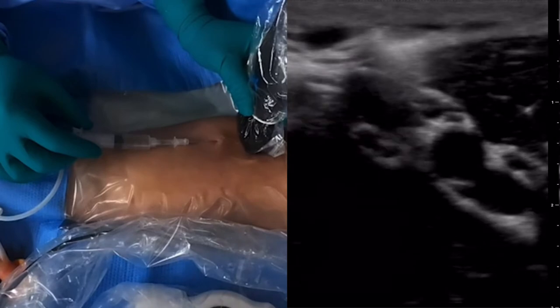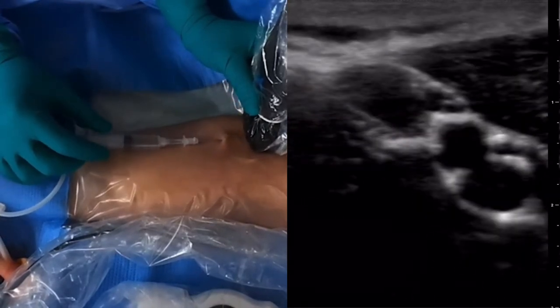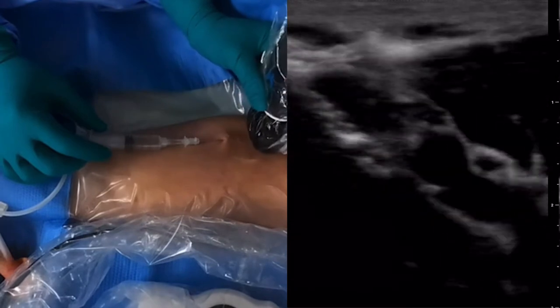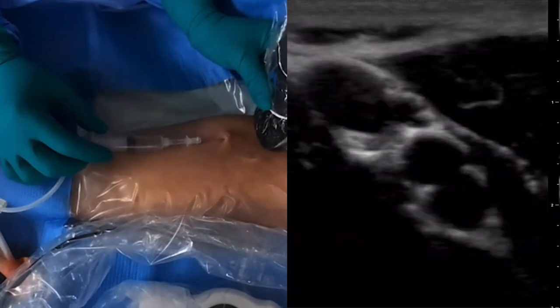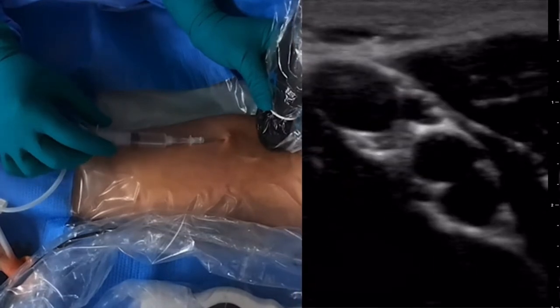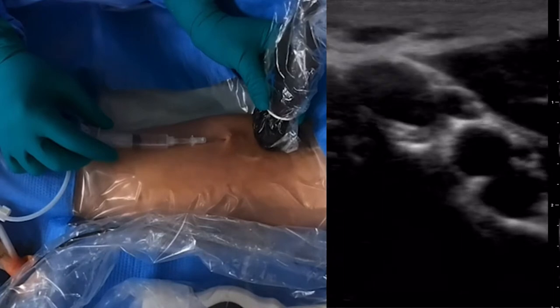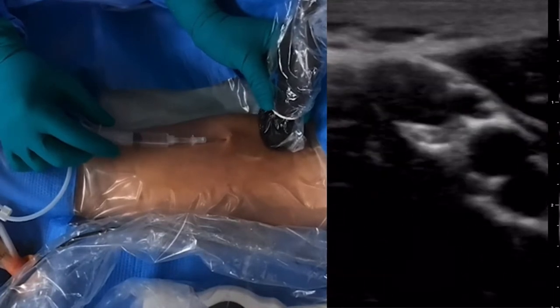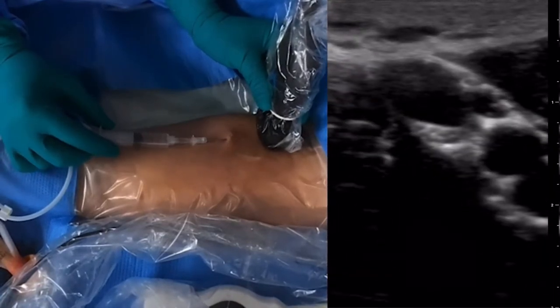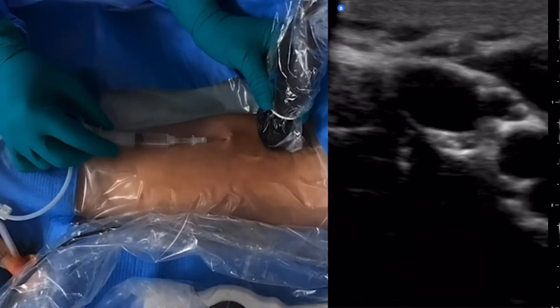We're going to continue to advance. Can you feel this? Not really. Good. This is probably about where I'm going to enter. We're going to inject lidocaine so he doesn't feel so much when we add the dilator in. Can you feel that? Not really. Good.